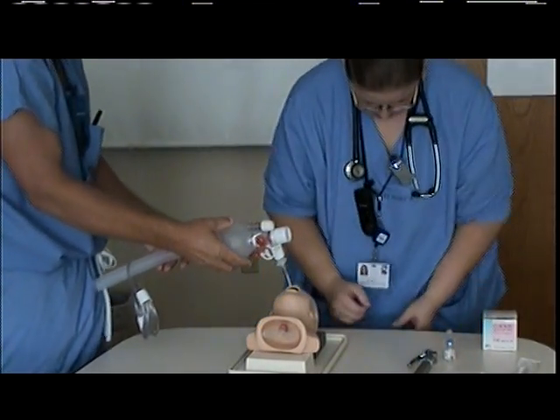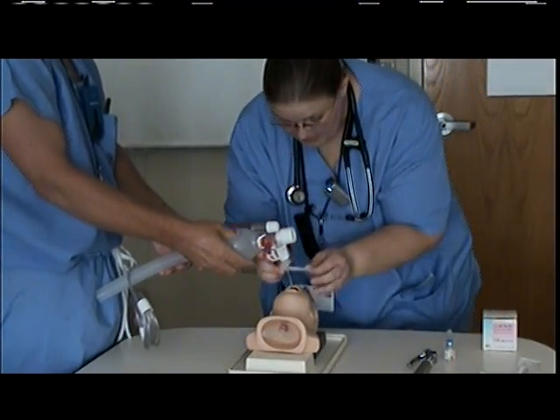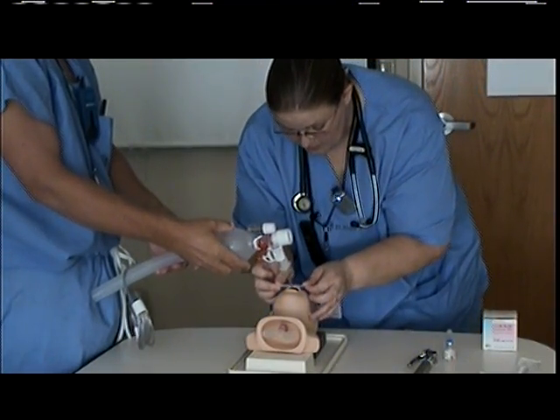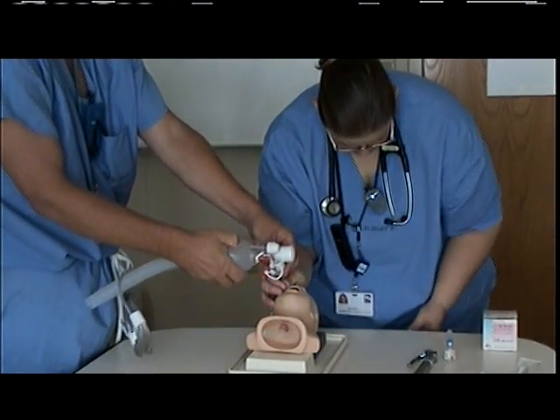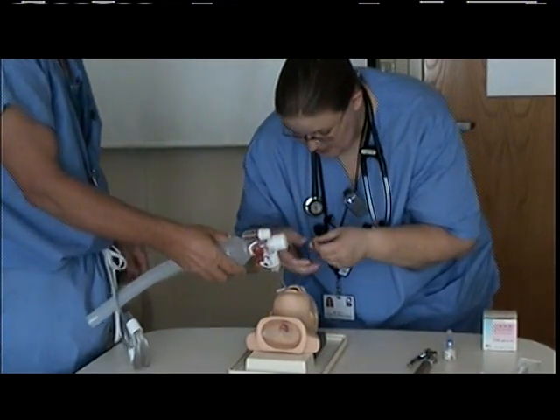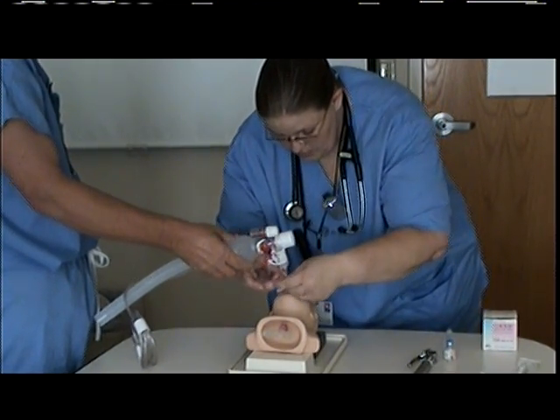Steve is going to bag for me while I tape the ET tube to secure it. I'm going to place my first tape over the top of his lip, move the tube to the right side, and take the second piece of tape which is cut in the middle, and wrap it around the ET tube.